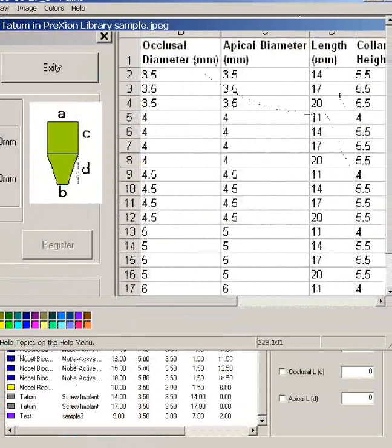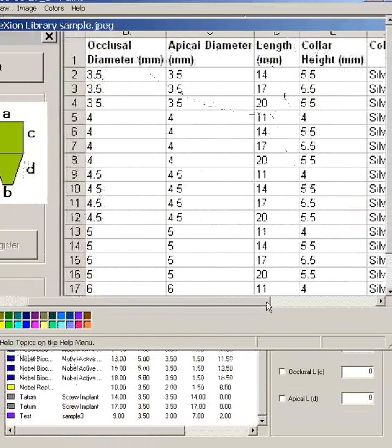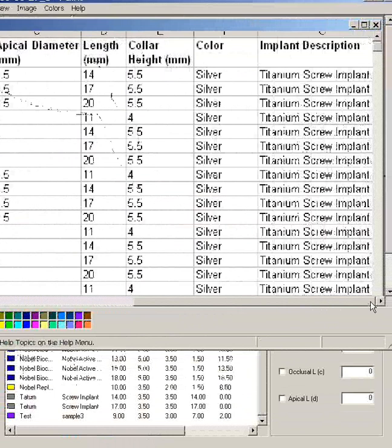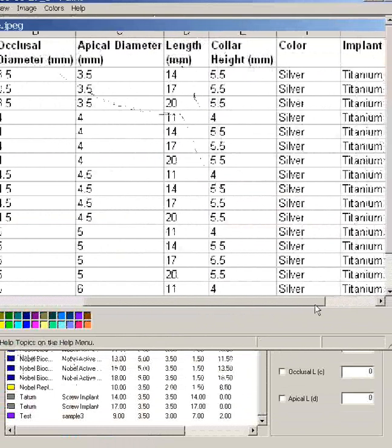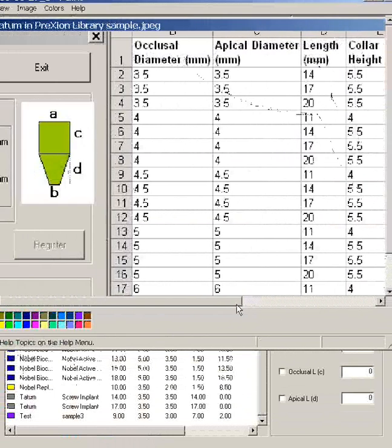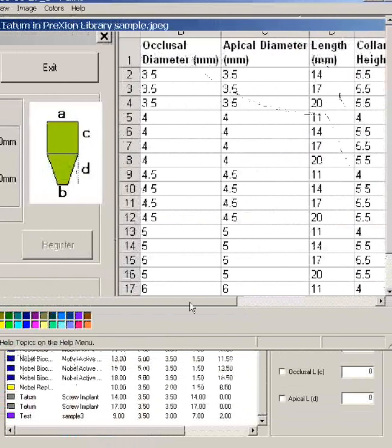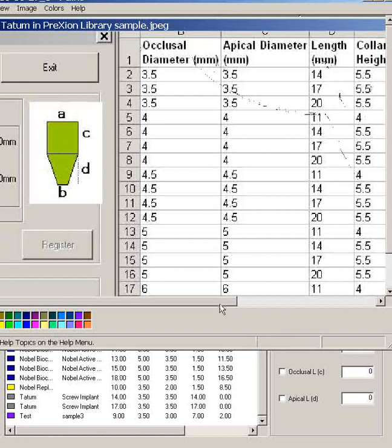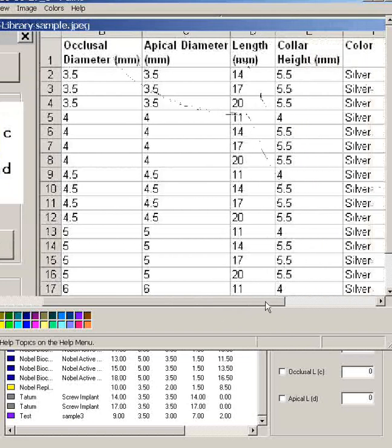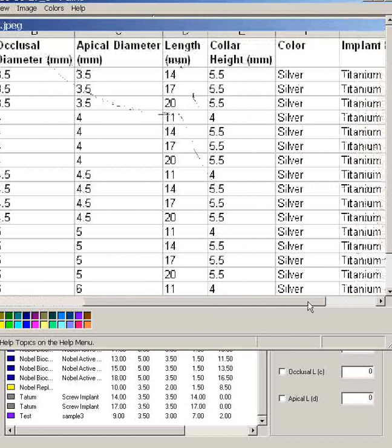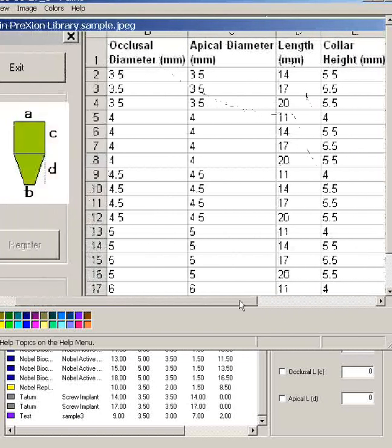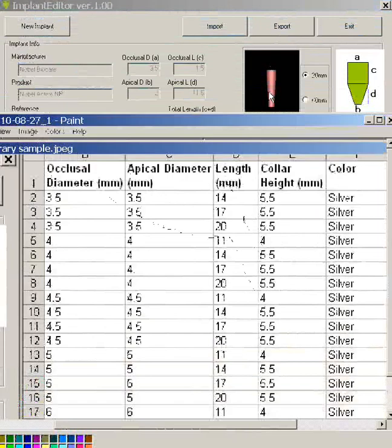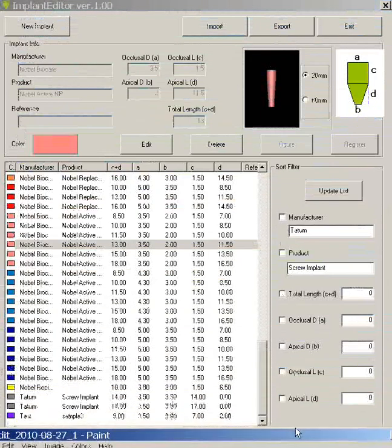Here for a moment let me bring in a particular file that was created and sent to us. And you can see this particular manufacturer has their occlusal diameter, apical diameter, length and even collar built in to their measurements. And so we would scroll and we've got descriptions and color and then we can register these in the implant library. So as long as you have these numbers and dimensions in millimeters we can add this to the implant library shapes.